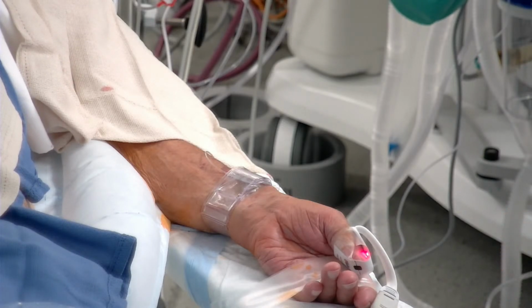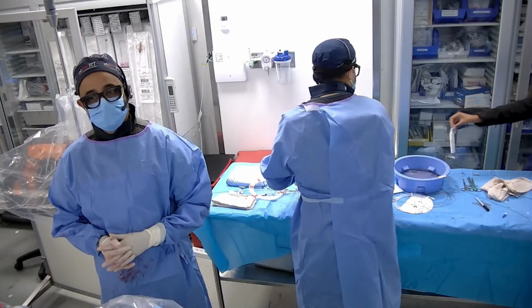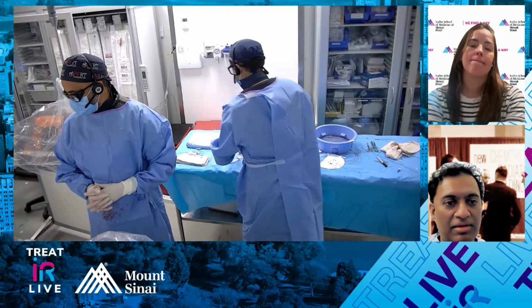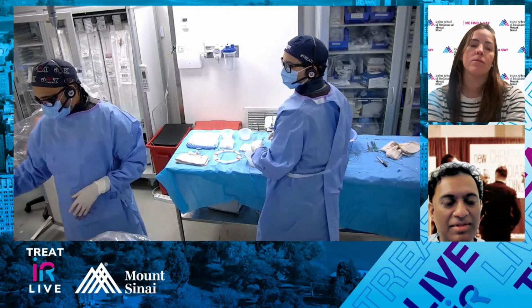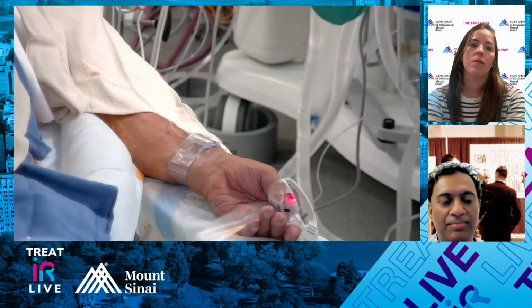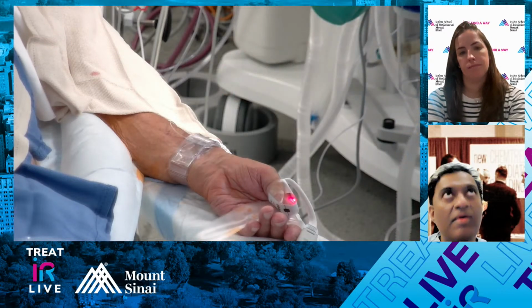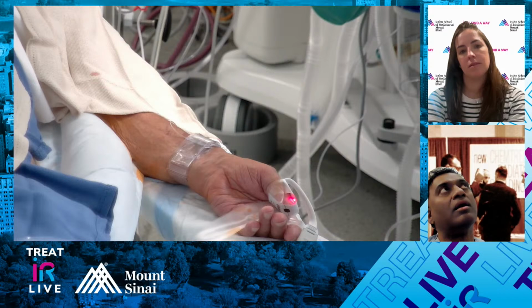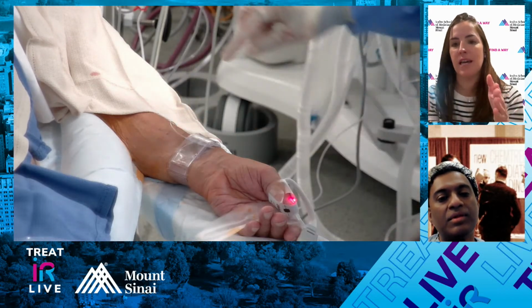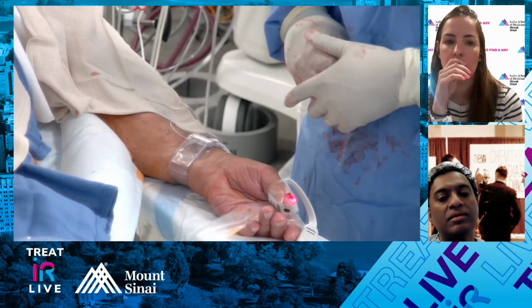Another question. You know how you have the tubing going towards the opposite of the fingers. Would it matter if you flipped it? The TR band? Yeah. Say you flipped it the other way. Yeah, the problem is the balloon is going to be on the wrong side, right? Correct. Because the balloon's only on half of the TR band. It's not really in the middle. Gotcha. It's on the side. Yeah, so it has to be that way.